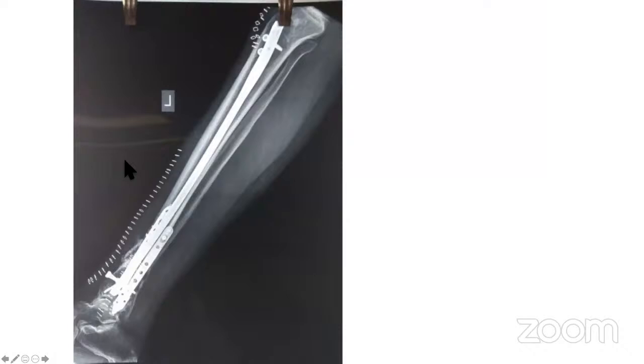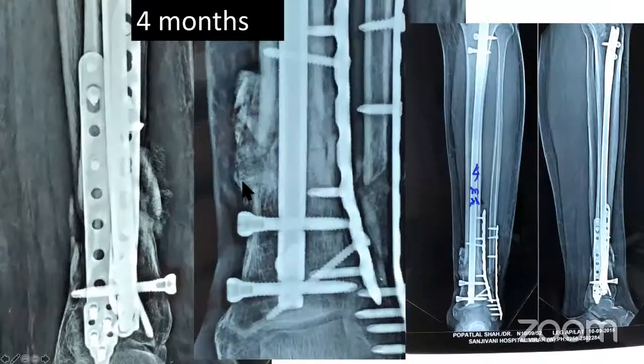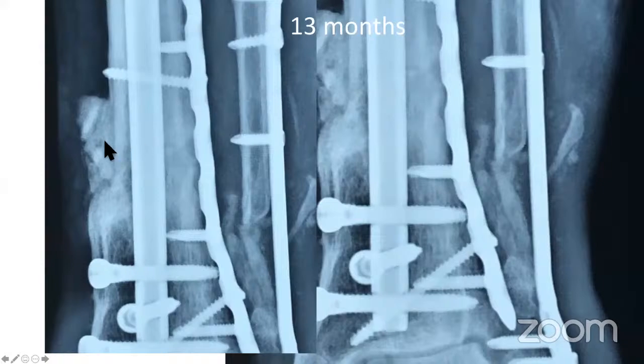You can see this is on day one. You can see beautifully the ankle axis and everything is perfect. After shingling here, bone grafting was done. This was immediately, and this was 2 months. You can see the bone grafting is taking over at 2 months, and at 4 months you can see a good bone graft. Up to here, I do this 2.5 inch of shingling. All that has now formed bone here. You can see this was the shingling. This also is forming bone. Now at 13 months, very well healed up.